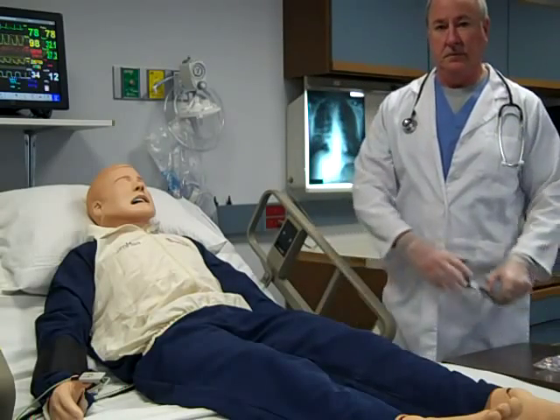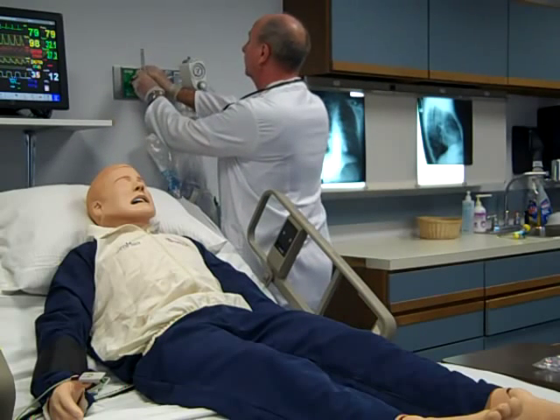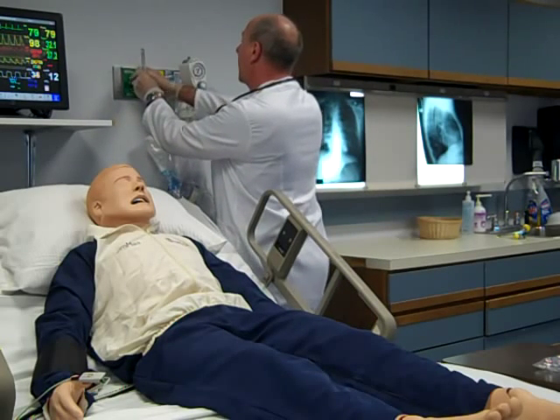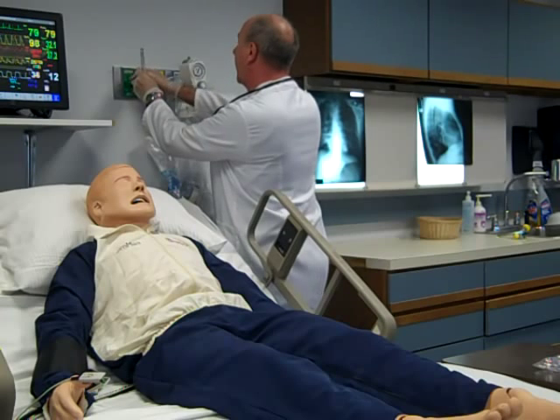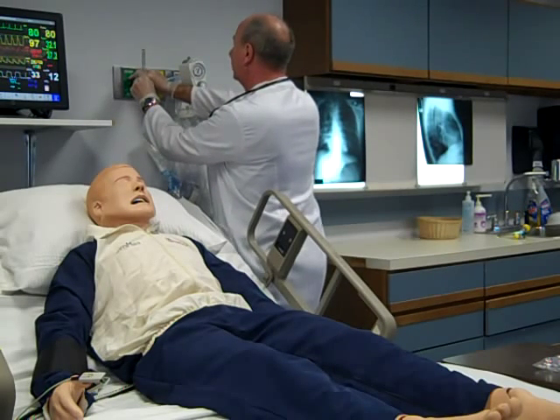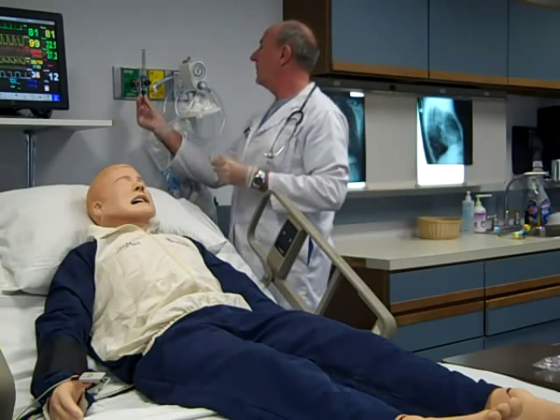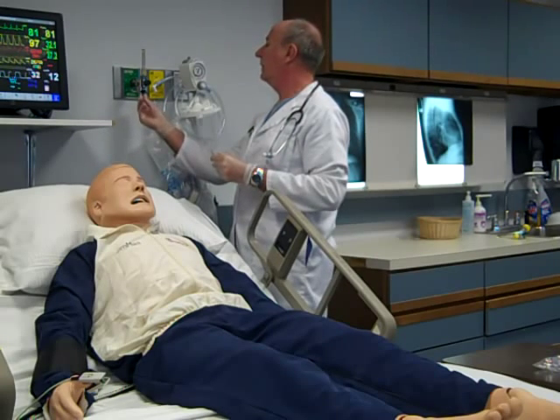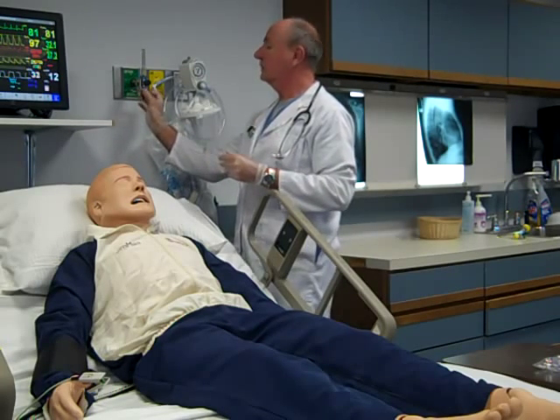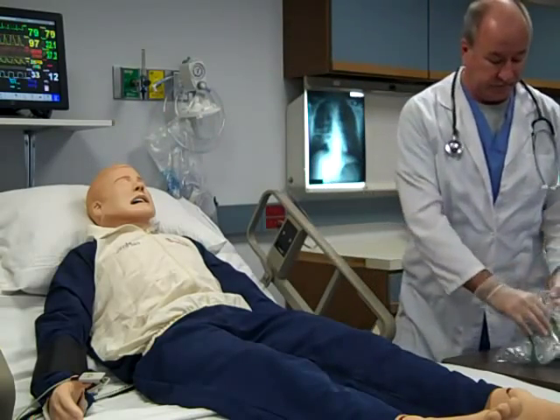Attach the flow meter to the wall outlet by screwing the flow meter connector clockwise into the wall outlet. Attach the nipple adapter to the flow meter outlet by screwing it clockwise until hand-tightened. Attach oxygen tubing to the nipple adapter.